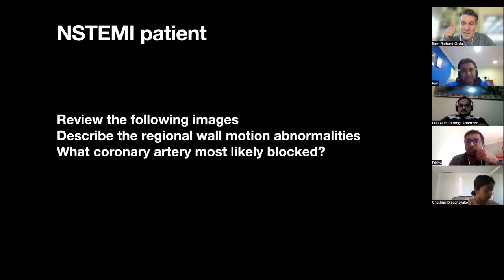You've got to know your walls, which I thought you described very well. We have to talk about segments matching up with each other. So one of the things I was going to ask you is, if you think the anterolateral wall is down, which view do you have to look at? And that would be the four chamber.